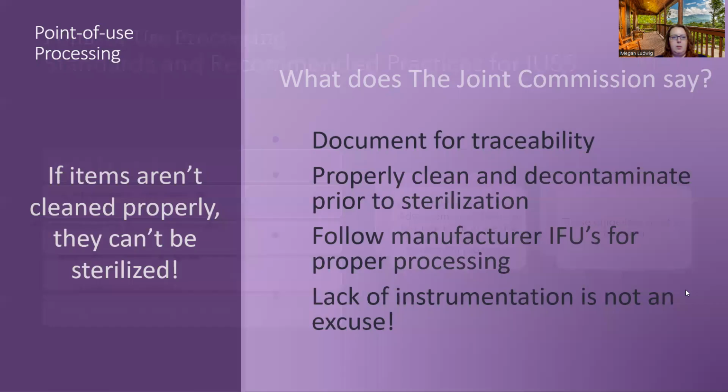Okay, so what about the Joint Commission? What do they say? Remember, the Joint Commission is the entity, you could say, that accredits all healthcare facilities: hospitals, ambulatory centers, doctors' offices, all of them. So they also set certain standards that have to be met to maintain accreditation, right? So they obviously have things to say about the whole sterilization process.